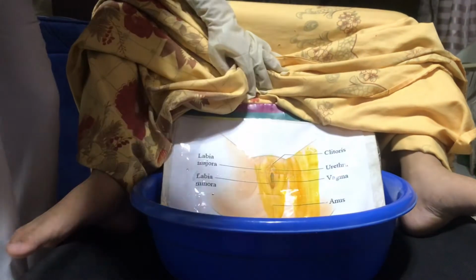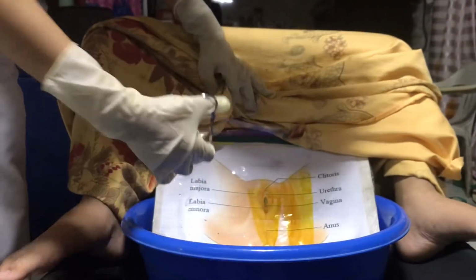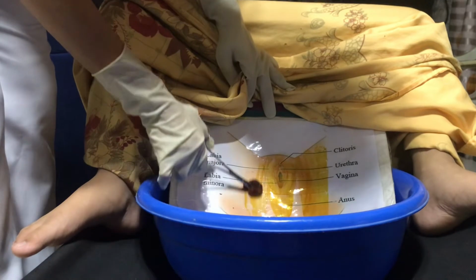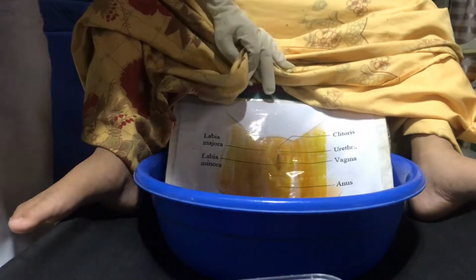Discard. Then the last one, up, down, then discard.